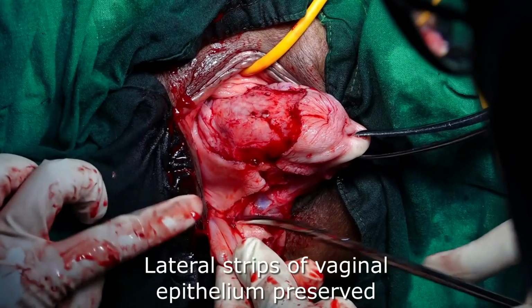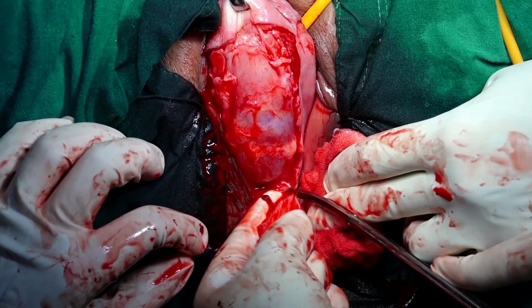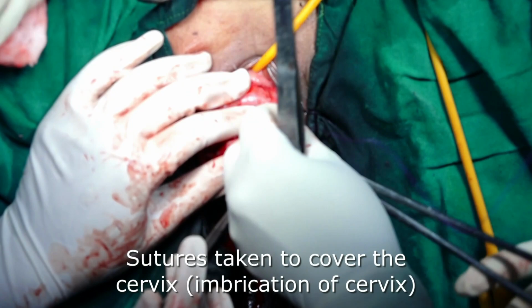Care must be taken to ensure that enough vaginal mucosa is spared at the edges to make a patent tunnel. The tunnel helps in the drainage of the secretions. The first suture is taken near the cervix.